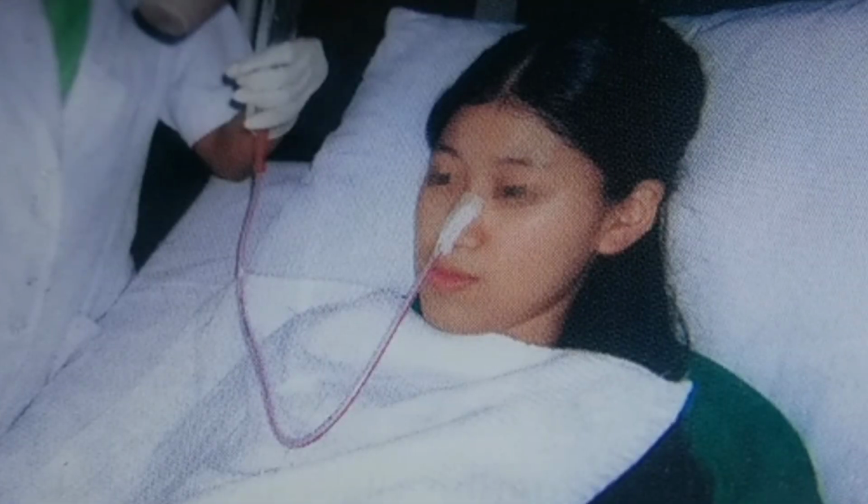So what is the procedure? Identify the patient and explain the procedure to the patient. If the patient is conscious, we have to explain the procedure to the patient. Why we have to explain: we have to reduce the patient's anxiety and ensure the patient's cooperation.